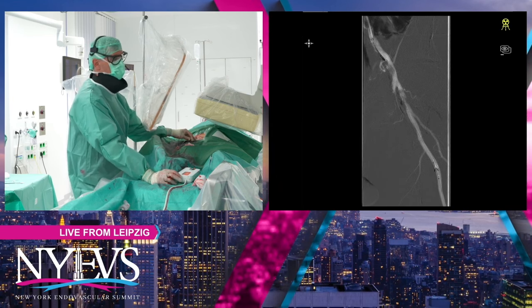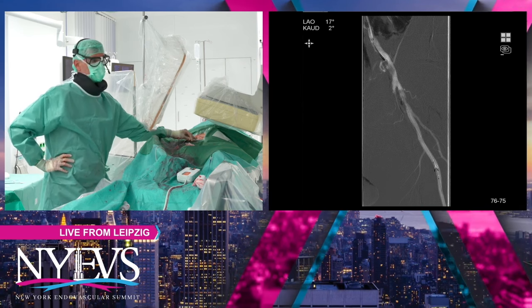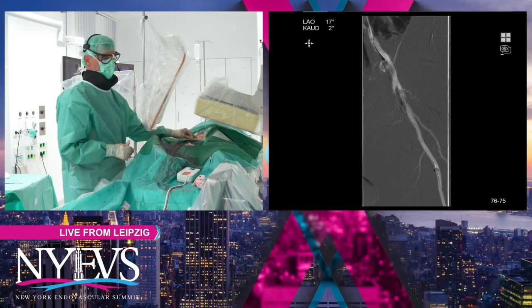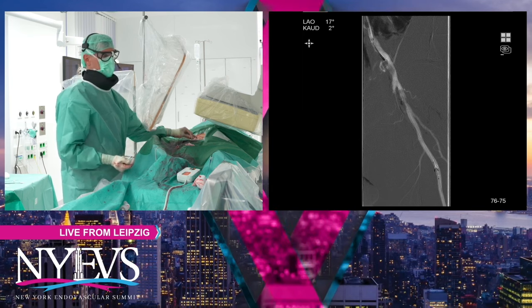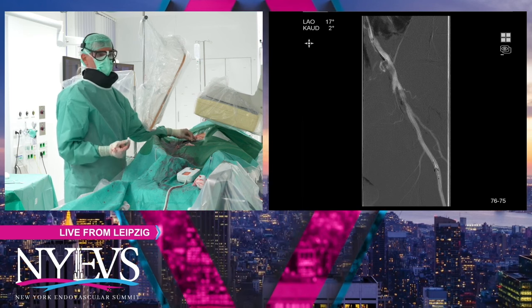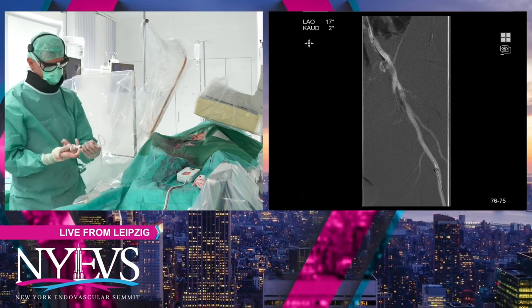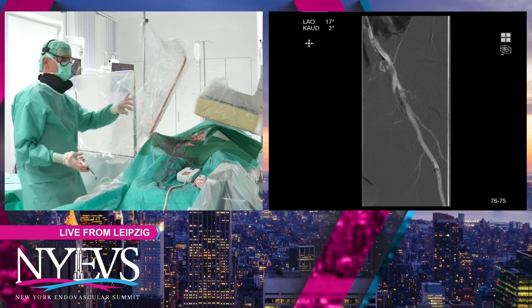Yeah, so very, very slow. First blades down, maybe 2 times, and then blades up. I did already try to get through the distal stenosis with blades up, but the rotation rate went down. So therefore I switched down again to blades down and did this once again. And now I want to try to once again do this with blades up, always with a protection device. I never do this without, especially in these calcified lesions. I can imagine that already now we have a very slow flow here on the Profunda. Maybe not a bad idea here to check.